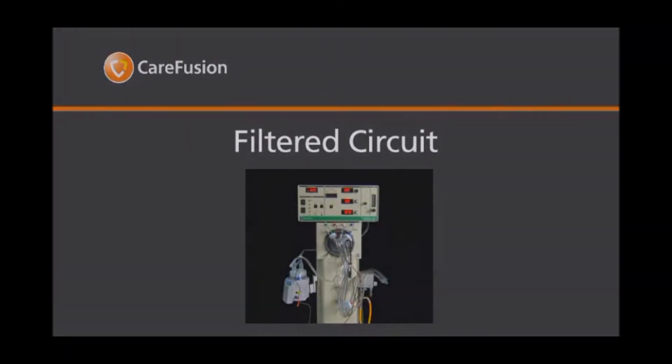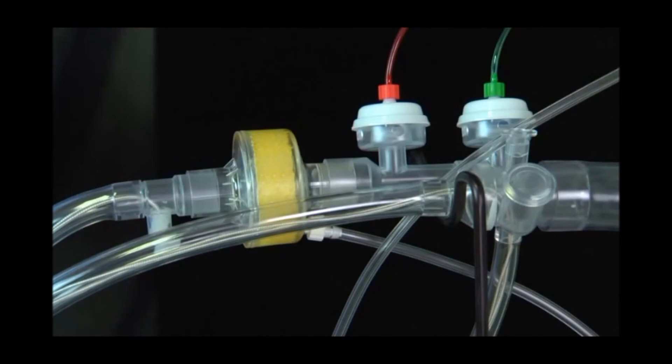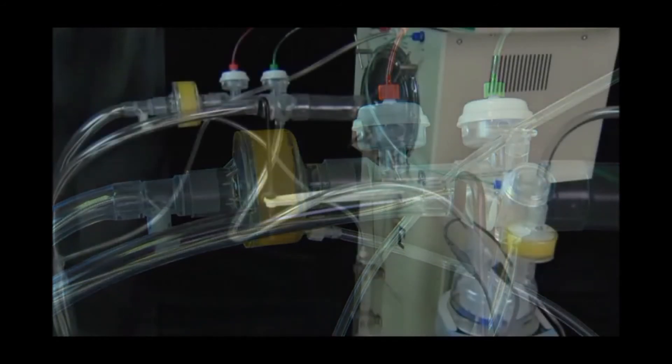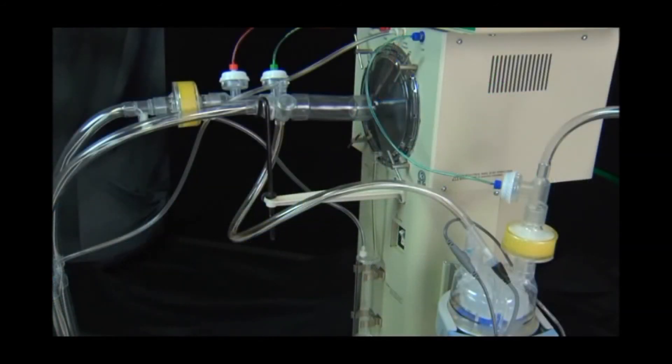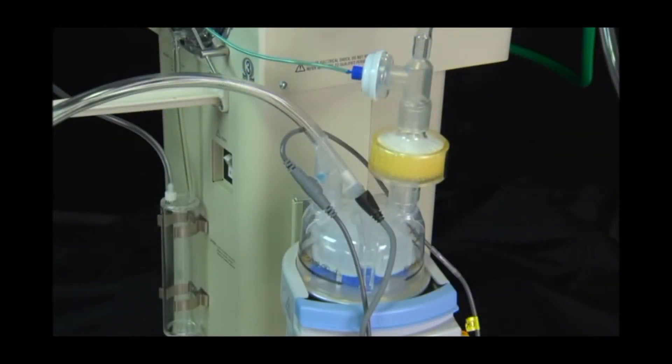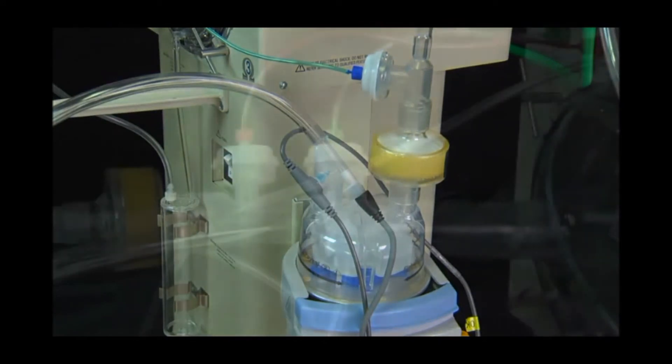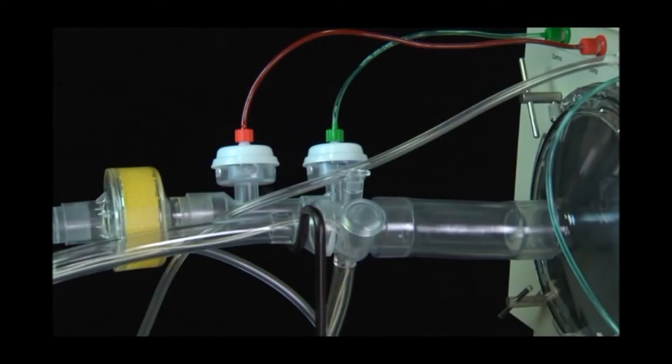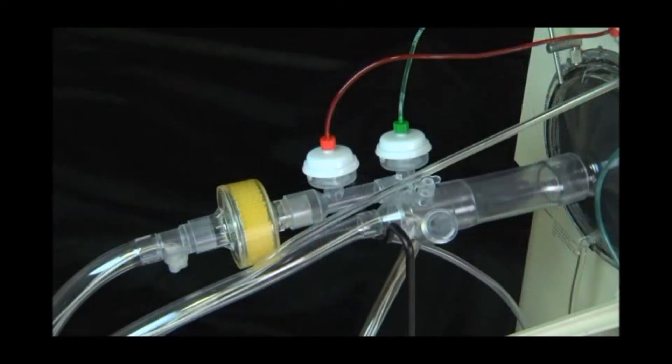The filtered circuit for the 3100 provides filtration of gas from the inspiratory and expiratory limb using a HEPA filter. The setup of the 3100 circuit is essentially the same as the non-filtered circuit. The limit valve is placed on the dry side of the humidifier chamber. This ensures the filter stays dry so it does not have to be changed. The dump valve has been moved next to the control valve behind the expiratory filter. Special connecting tubing for filtered circuits is provided to account for these new valve positions.